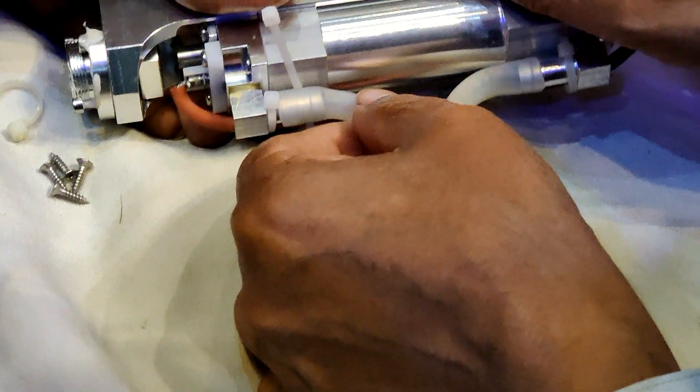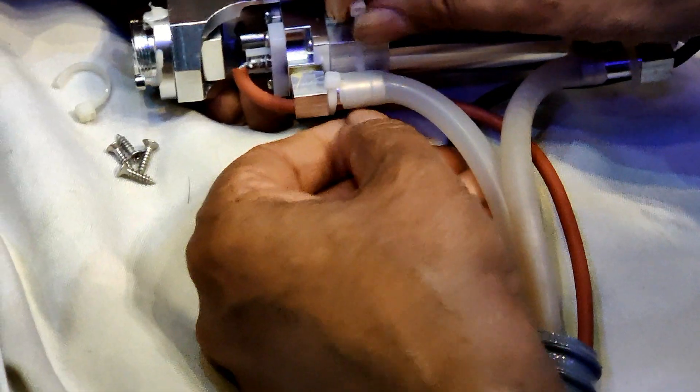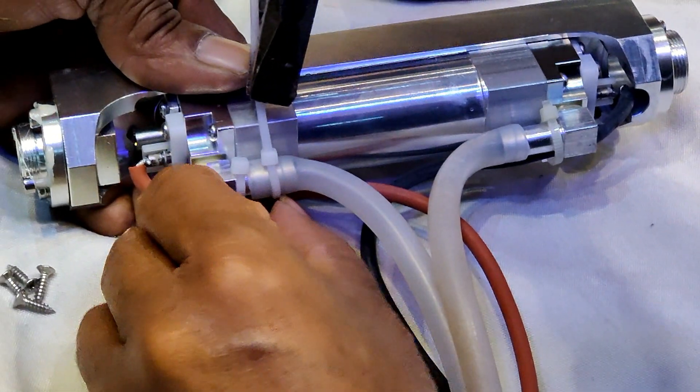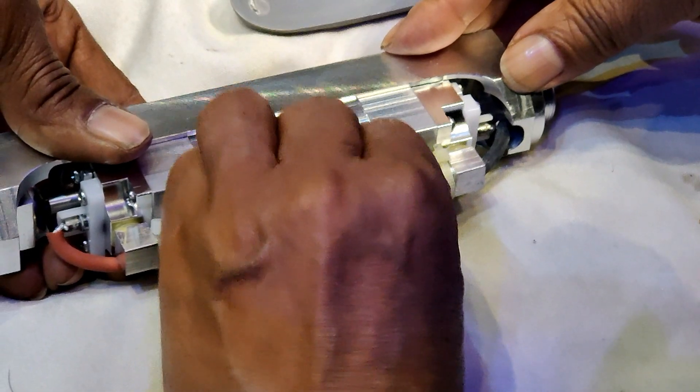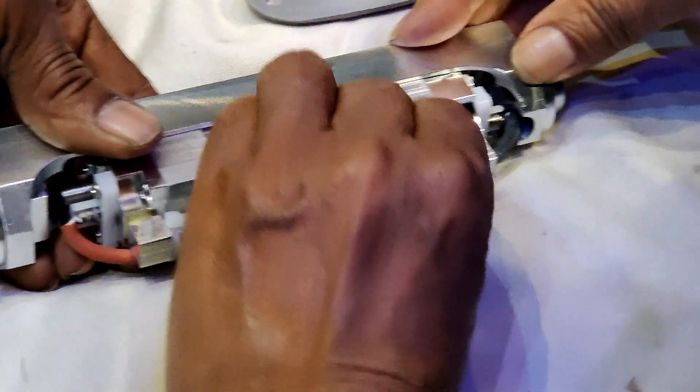The damaged part of the silicon tube is here. Now I am applying the zip tie to hold the needle in place. Now we are fixing the probe.